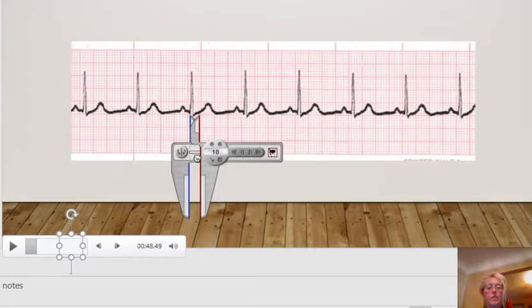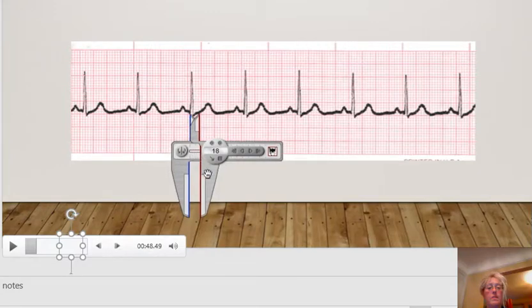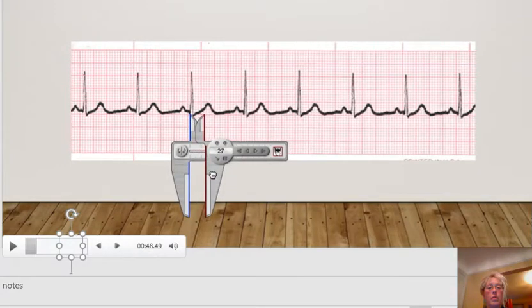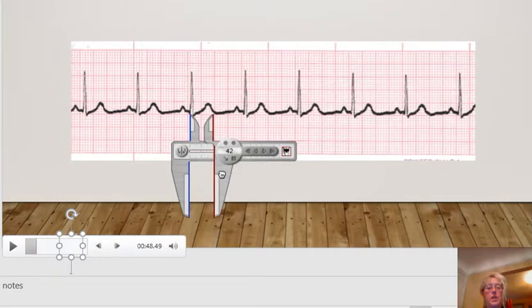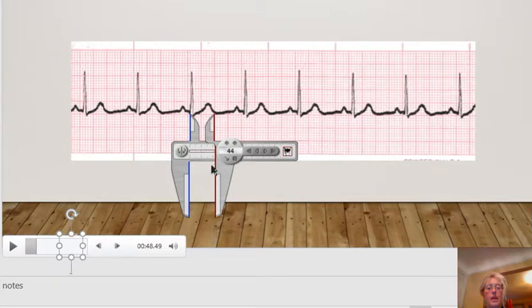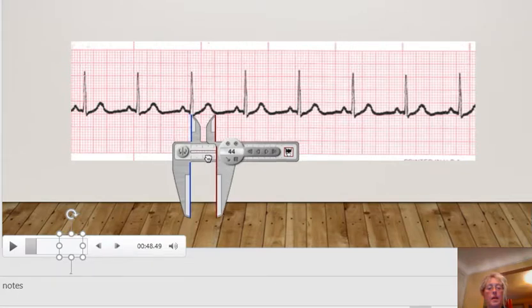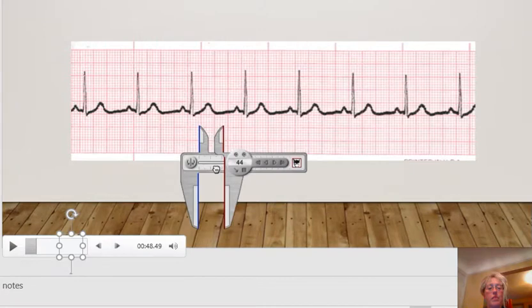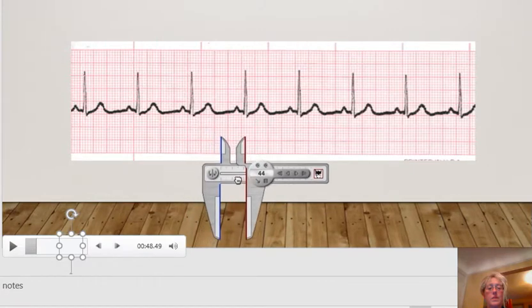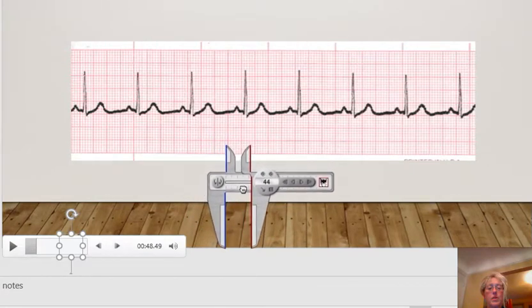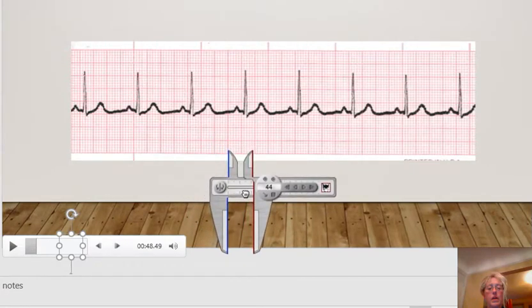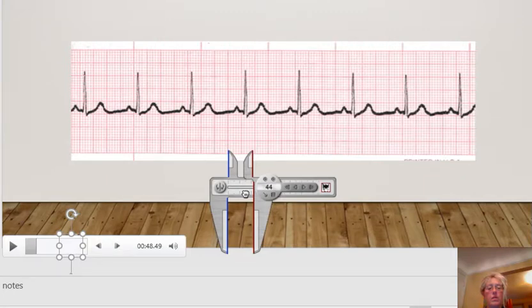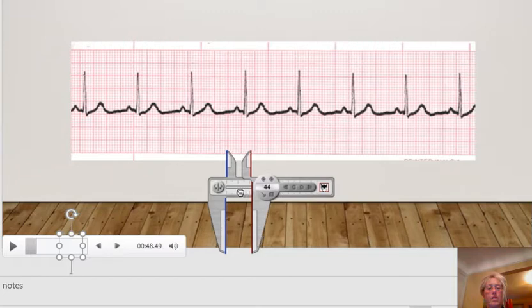So we've got about four little boxes. And let's move it all the way over to where the T just about hits the horizontal, right about there. And then we'll take our calipers again and place them on a vertical line so it's easier to measure. Okay. So our QT seems a little narrow.